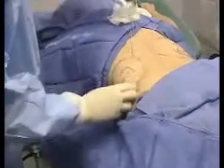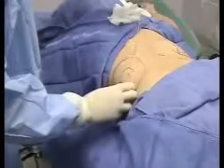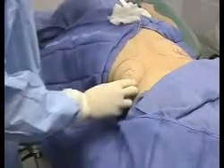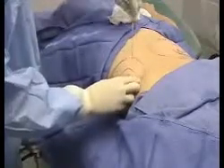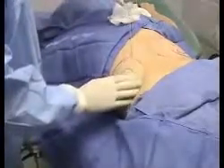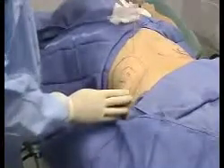And I think it needs to go at a fairly slow speed. If it goes very, very fast, it's kind of like licking your finger and touching a hot pot real quickly. You don't get much of a heat transfer. So I'm always conscious and trying to remind myself that we're trying to go super slow.